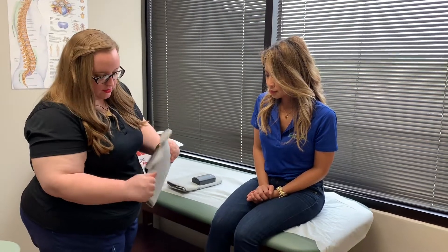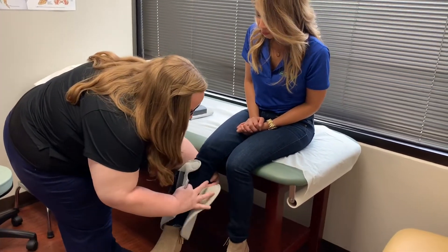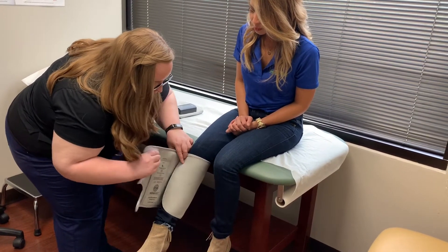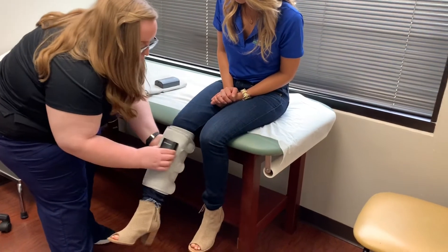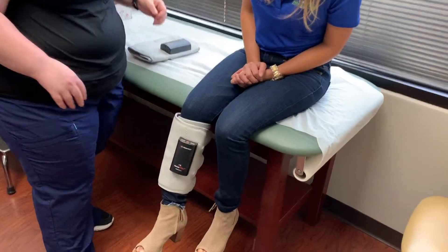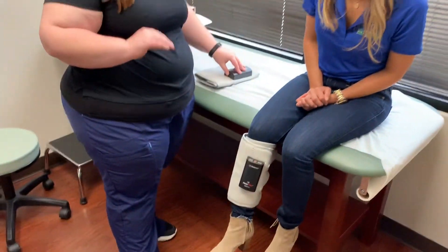So now I'm gonna show you how to properly put this on and how to use it. Just gonna un-velcro here. These should be one-size-fits-all. You're just gonna wrap it around your calves, velcro it, and then when you push the power button it gives you four hours of life and you're gonna want to wear these anytime that you are sitting or laying down.